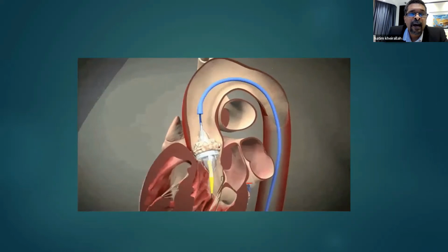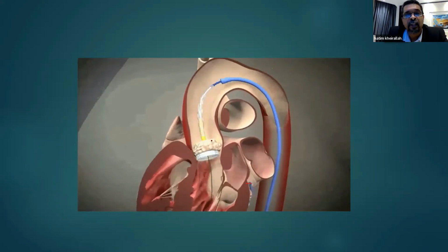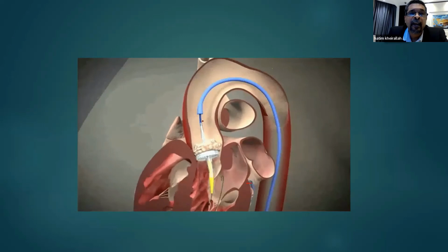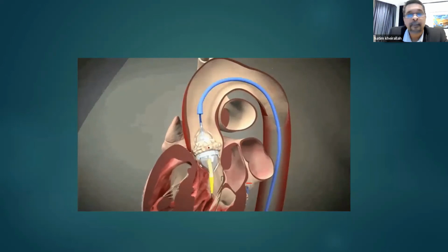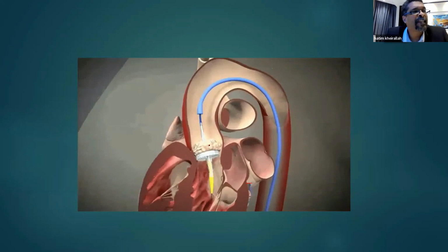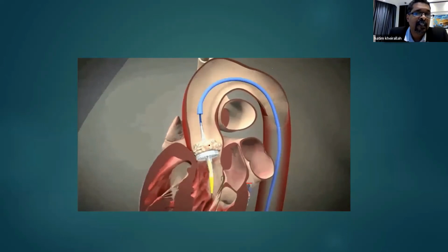If you have a bioprosthesis in the mitral or aortic position and it gets degenerated and the patient is high surgical risk, you can go with a bioprosthetic valve newly mounted on a catheter, and you go down here, position your valve, and inflate it against the old valve, and that's all. It's an easy procedure, easier than the clip.